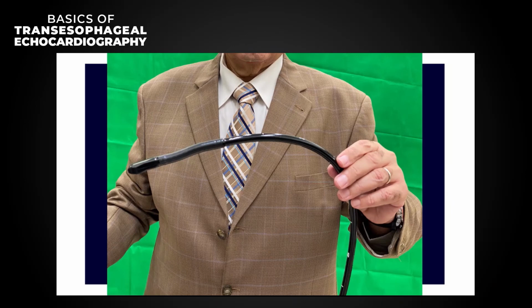If you are going to check for infected pacemaker lead vegetations, the pacemaker leads pass through the superior vena cava, so I should go to the bicaval view. For a sinus venosus ASD, I should also go for the bicaval view. If I want to check the mitral valve, I go at variable angles from 0 to 180 because I'm going to see different scallops. So it depends upon the indication for the TEE, which structure you are going to look for.